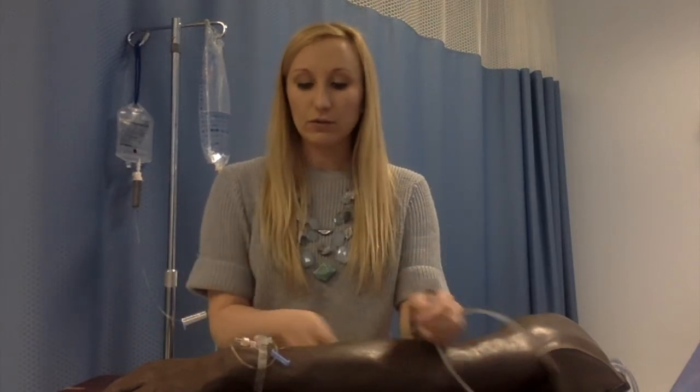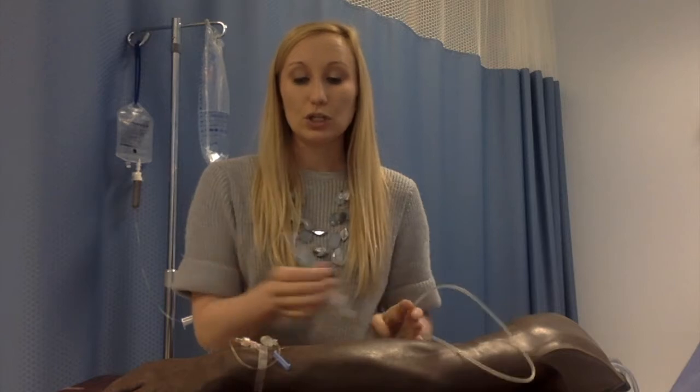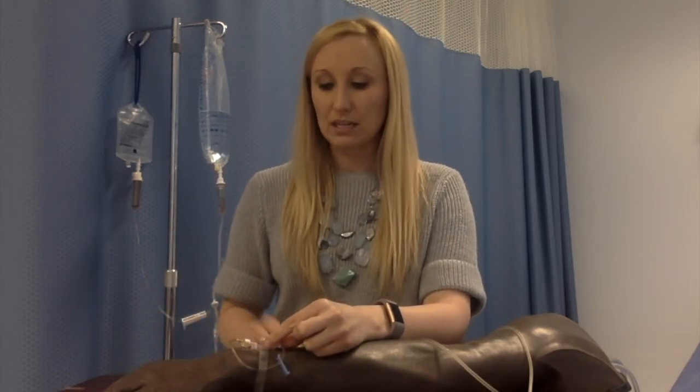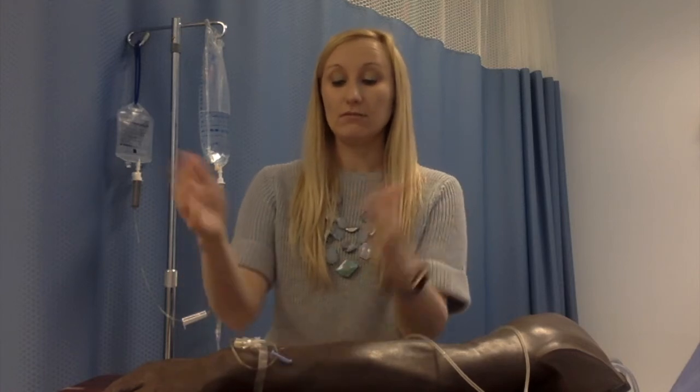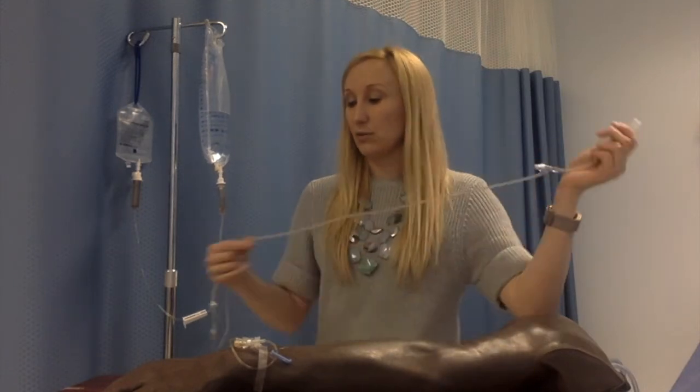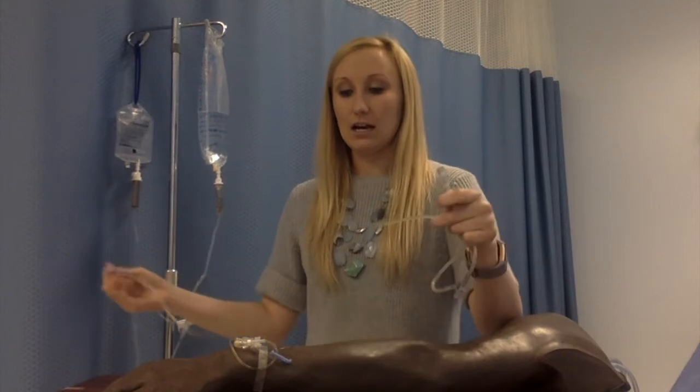So you would clean off your site really well. You would administer your saline into the heparin lock. Then you would administer your medication. And that just looks like cleaning it off and then just inserting the needle and pushing the medication in. Then you would insert your saline and then heparin. And then you would just close it back off, and you can just keep it, and you have easy access to the vein.